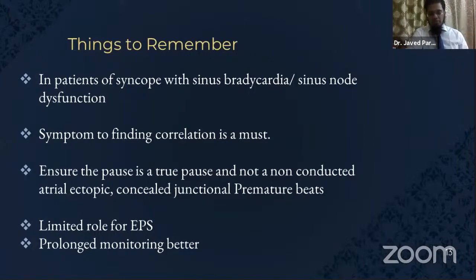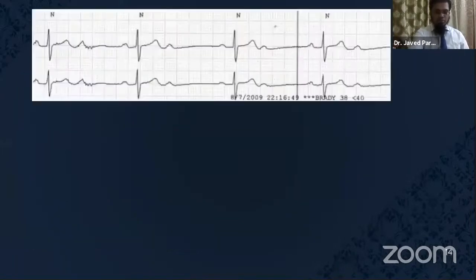In patients with sinus node dysfunction, electrophysiological study has a very limited role, because most of the clinical decisions can be made by routine testing. On electrophysiological testing, you can confirm that the patient has sinus node dysfunction, but you cannot produce a pause, so it is difficult.